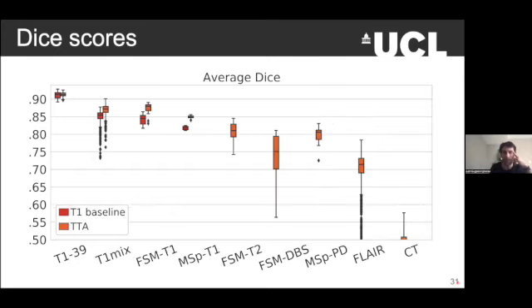So test time adaptation, a good thing is that it doesn't break anything in this domain, which is good. And it seems like on the T1 datasets, it does buy you a couple of points of performance, which is nice. And when you look at the other domains, sometimes it does a reasonable job. It seems like in T2 and proton density, it's able to bring the network to a reasonable spot and give you like 0.80 dice, which is not amazing, but not terrible either.